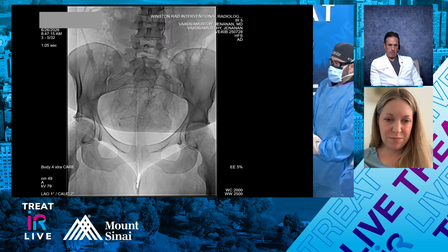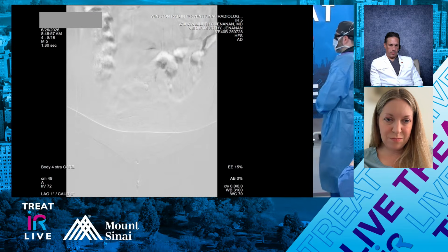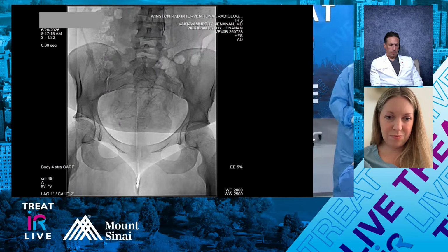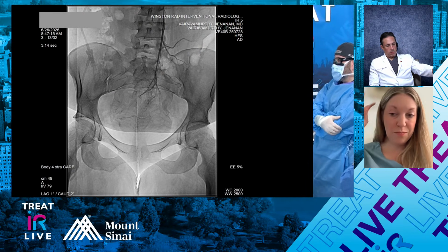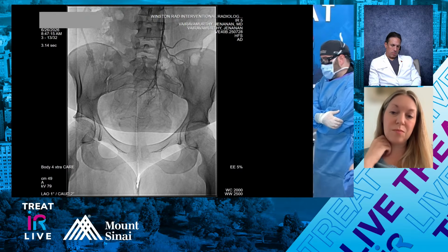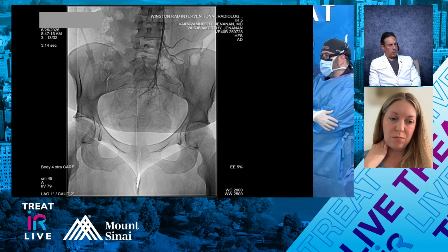Yeah, I mean, we talked a little bit about it with the embolics, our impulse to transition to liquid. What do you guys think is going to be dramatically different? Jesse, take 3 years from now, what are we doing that's going to be different? Or maybe nothing at all. Maybe we're doing it the same exact way other than the embolic. Do you think something's going to change in terms of follow-up, going forward?